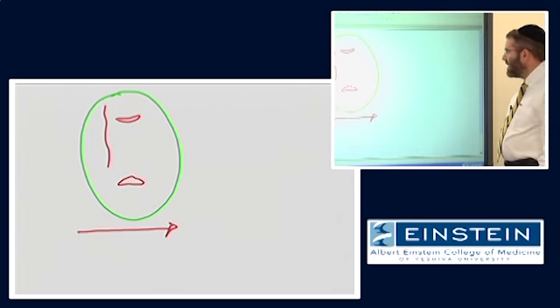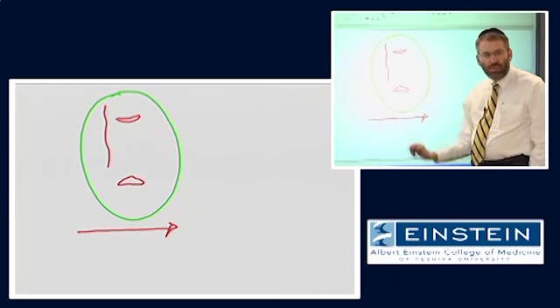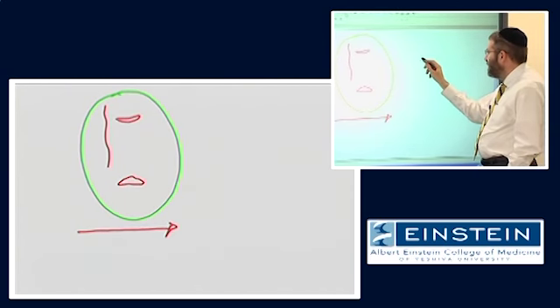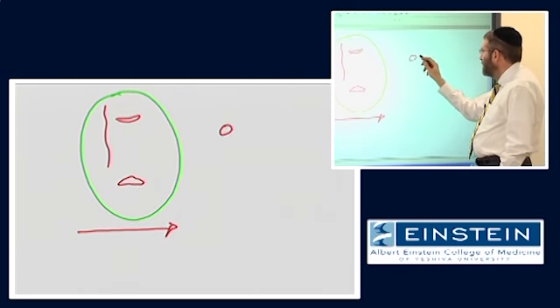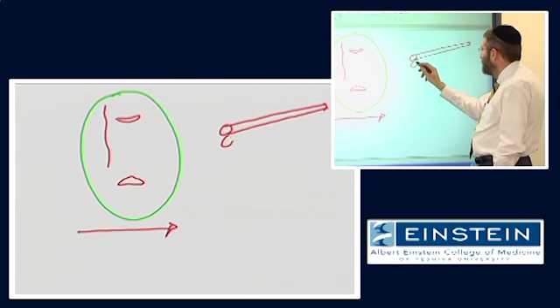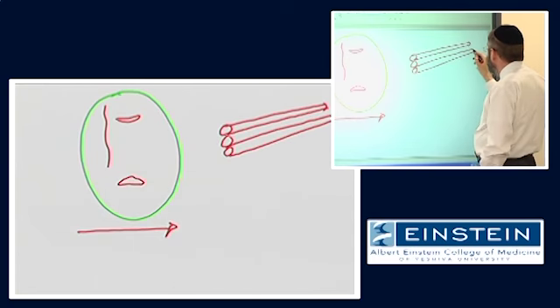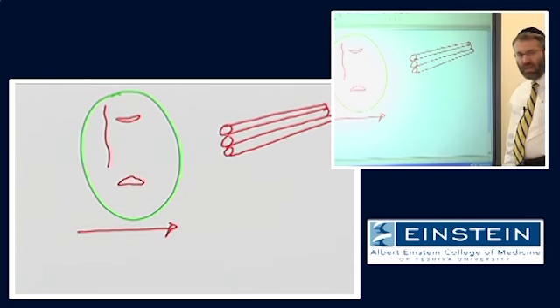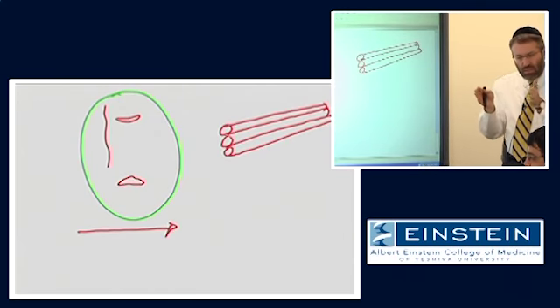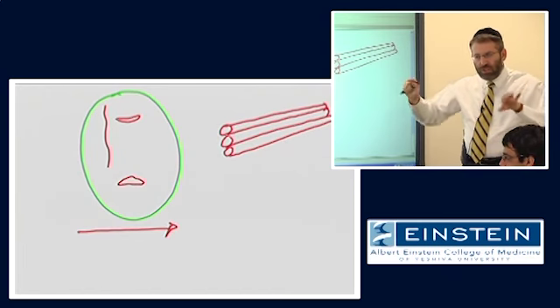The reason that is the case is that in white matter, and I deliberately chose these two white matter regions, if we think about the anatomy, we basically have many structures that look like this. We have bundles of axons which are all running, within some constrained distance, along a single direction.